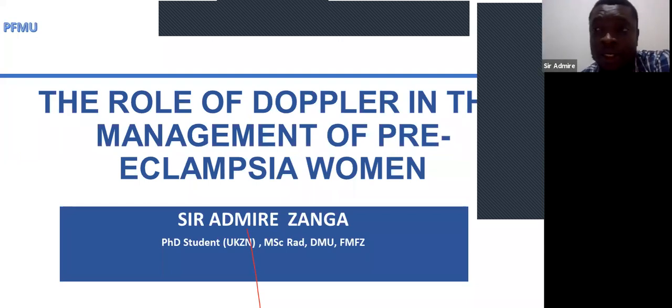Okay, all right. So for the MCA, all these Dopplers, at the fetal medicine level we perform all of them on all our patients. But it becomes very significant after 32 weeks, whereby it's an indicator of fetal hypoxia or acidosis. It's a pointer towards that. So after 32 weeks its significance becomes more pronounced. But even before 32 weeks, we still have to document it. After 32 weeks, it becomes a major determinant of the decision to deliver or the frequency of surveillance.